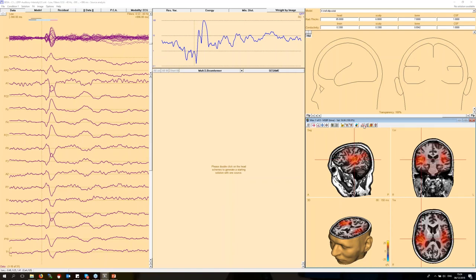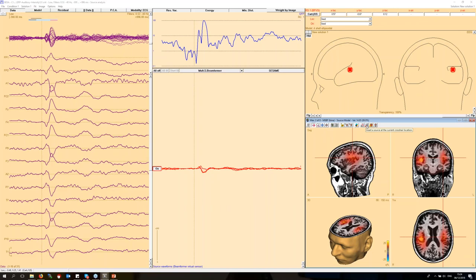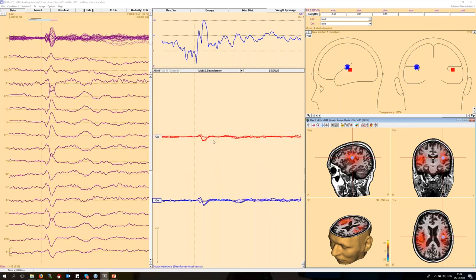insert virtual sensors using these results. So if I use this toolbar button to insert a source, you can see this symbol appearing for a virtual beamformer sensor. Go to the next maximum and do the same thing here. And then I can reconstruct the time courses for these virtual sensors. I can see them here appearing around the times where the auditory main activation happens. I could even now create source montages using these sensors, just like with any other source model in BESA Research. So yeah, I think that's a nice addition to the source montage and tools we had also in the past.